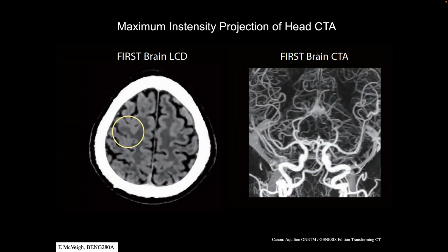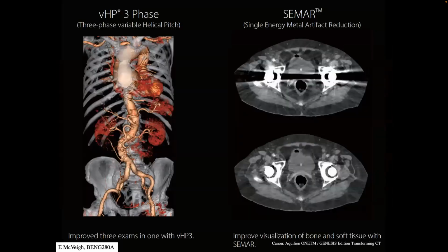And so if somebody's having transient ischemic attacks or something like that, and you're trying to find a source for that, then you get these beautiful pictures of their brain. You can very quickly get a large field of view of vascular and soft tissues. So this exam, they have a very fast rotating gantry, high helical pitch, it's called, where the patient just zooms through in about a second, and you get all of these data.